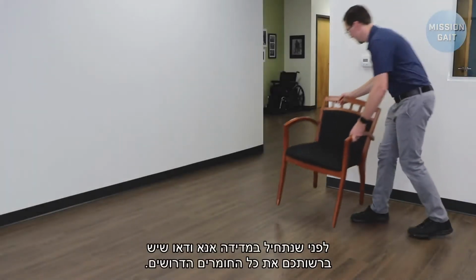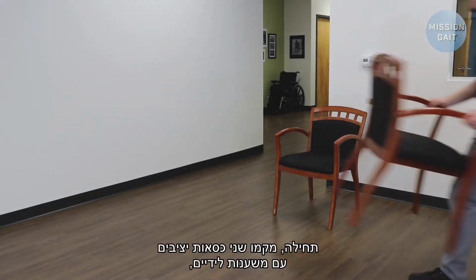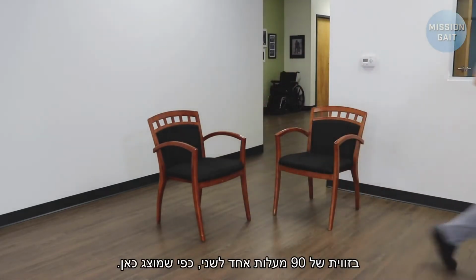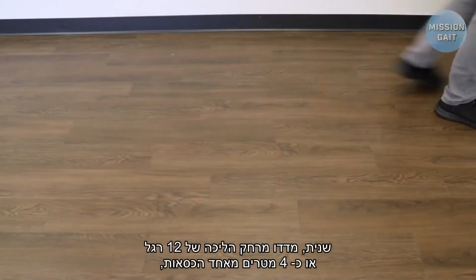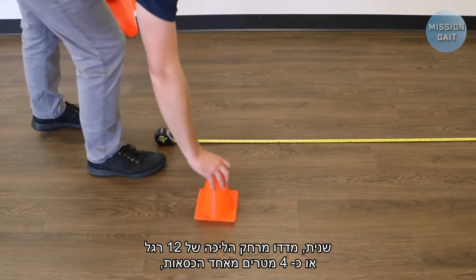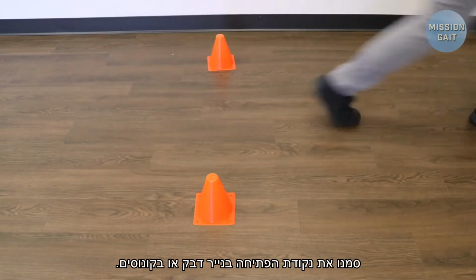Prior to starting this measure, make sure that you have all necessary materials prepared. First, place 2 hard chairs with armrests at 90 degrees to each other as shown. Next, measure a walkway of 12 feet, or about 4 meters, from one of the chairs. Mark the endpoint of the runway with either tape or cones.